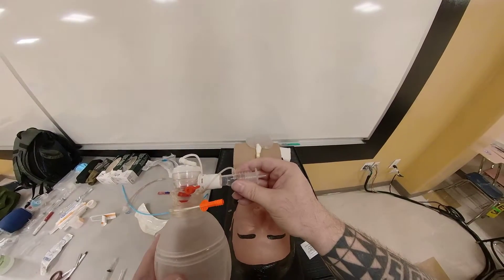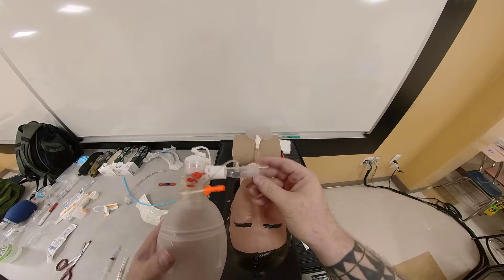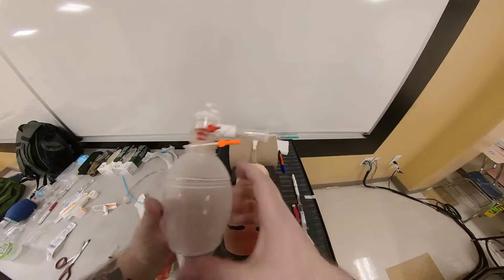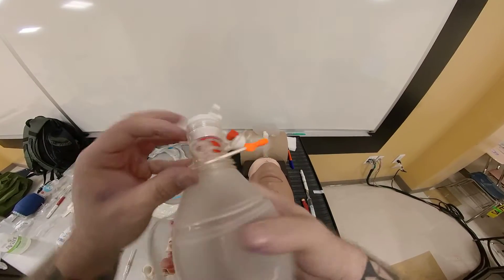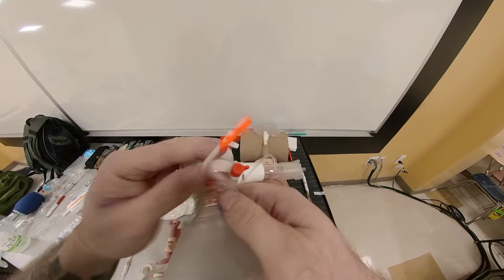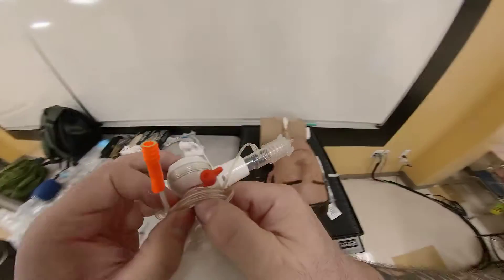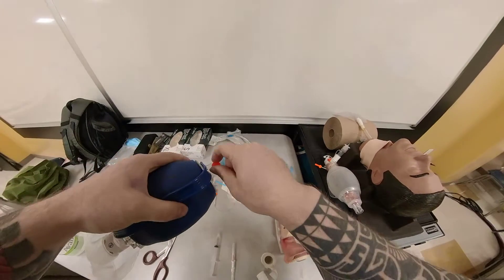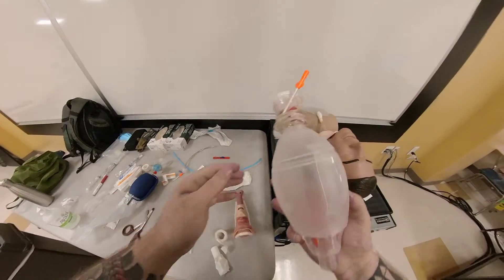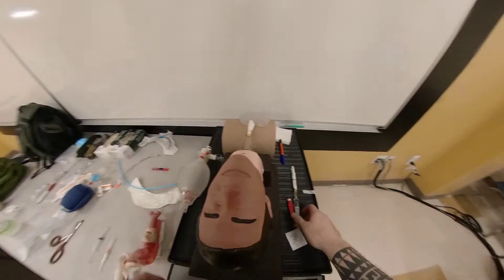I have my end-tidal CO2 pre-connected. You'll notice this is a 3.0 ET tube connector, and you must have a 3.0 connector from the ET tube — otherwise you won't be able to connect your BVM. I'm using a pediatric BVM because you don't need a big adult BVM to squeeze; it's going to be very hard for you to squeeze. You want to make sure the pop-up valve is overriding — you don't want it to engage, so you want to close it. If you start to exceed your pressure, this valve will pop up, and I don't want that here, because I want it to deliver enough pressure to actually obtain chest rise. So I'm going to close it — 3.0 ET tube connector.